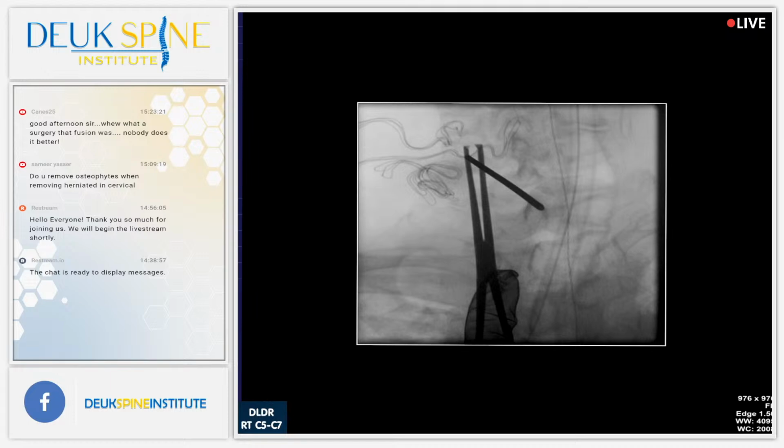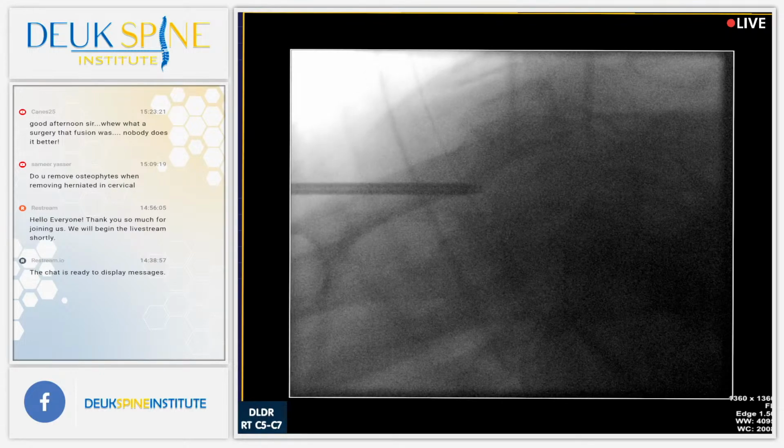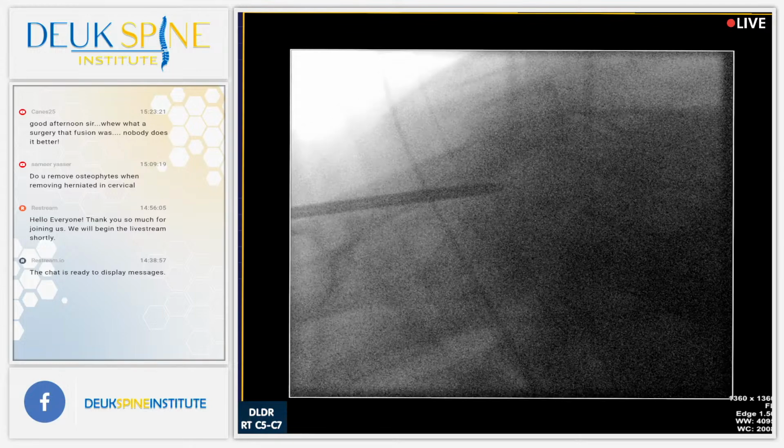All right, we're good on the middle. So I'm right over the disc, but I'm really having a fit trying to get this down here. I might get it. Shot. That looks really good. Mallet. I'm going to try to anchor and pin the tip right in the front of the disc. Shot. All right. Well, I'm getting some resistance though from his clavicle. That's the problem with these thick necks and high clavicles.